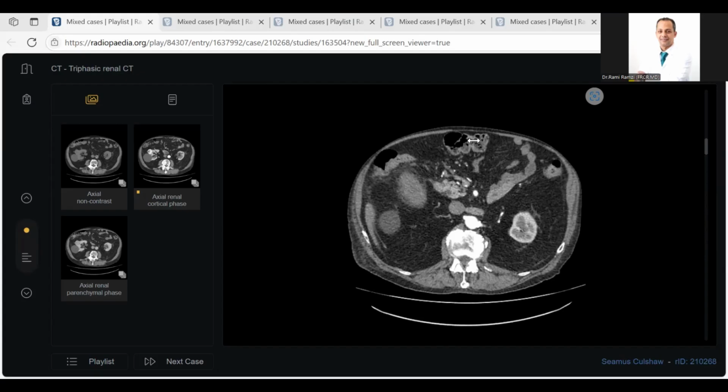Yes, excellent, Dr. A. Thakur. Yes, excellent. There are too many correct answers. Oncocytoma, excellent. Candidate 15 and 17, excellent. All the answers are correct. You can differentiate oncocytoma from RCC, not by radiological means.